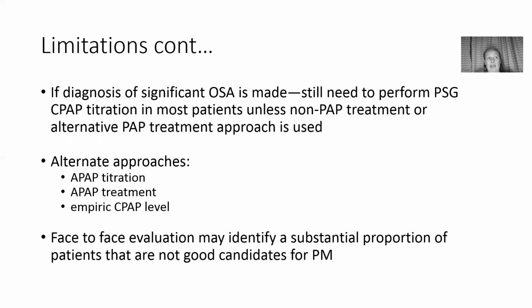The reason for that is it gives patients time to acclimate to their pressure in their own home, kind of work out some of the troubleshooting there on their own. So when they come back for titration, they usually do much better. The downside of that is the patient could easily get frustrated with the CPAP at home and quit using it right away, and so on.